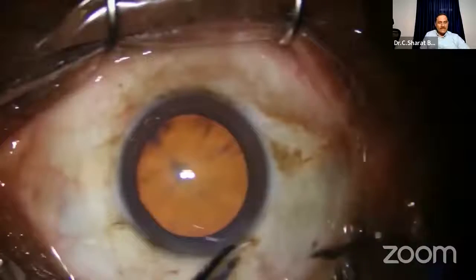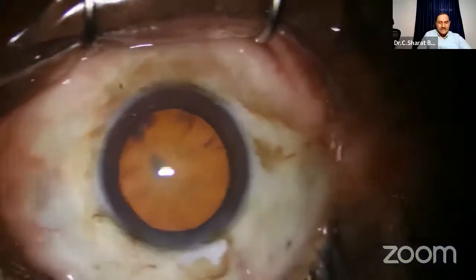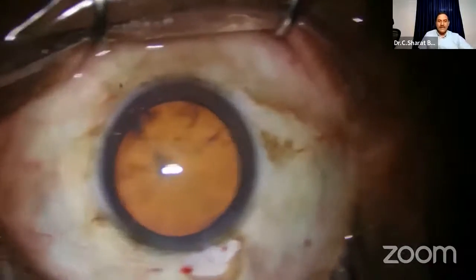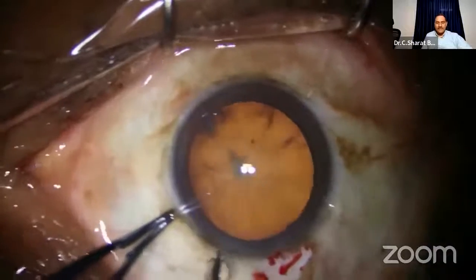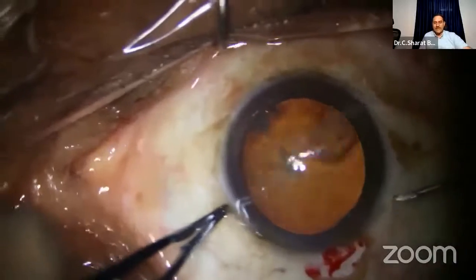The challenges here: one is the incision. My incisions are always post-limbal, and in this patient also I've done a post-limbal. To prevent ballooning of the conjunctiva and Tenon's, I just open up a little here. The second challenge is to do a clear CCC. I put a lot of visco inside, pushing back the anterior capsule. Usually I do my side ports on both sides with a 23G cannula, and then with a 26 needle I've done a capsular excision.